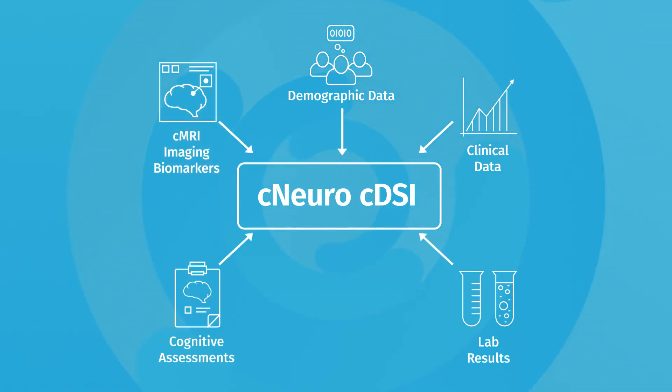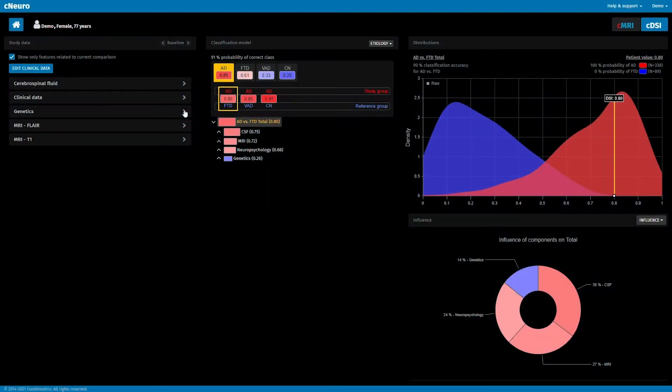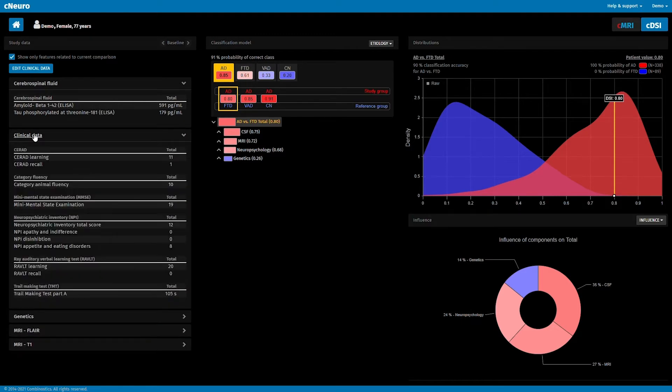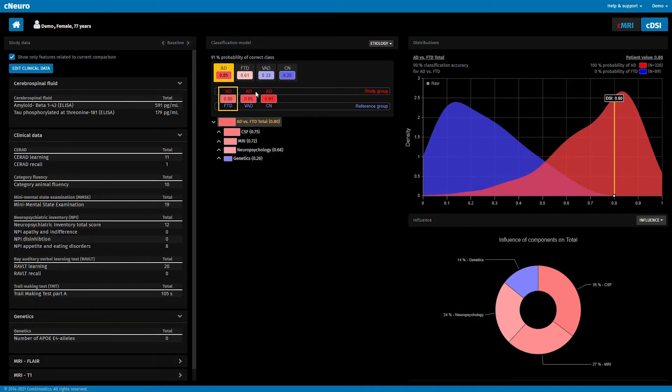For this patient in C-DSI, we have C-MRI results as well as biomarkers from cerebrospinal fluid, neuropsychology test results, and genetic information. These data are compared to a large database from previously diagnosed patients.